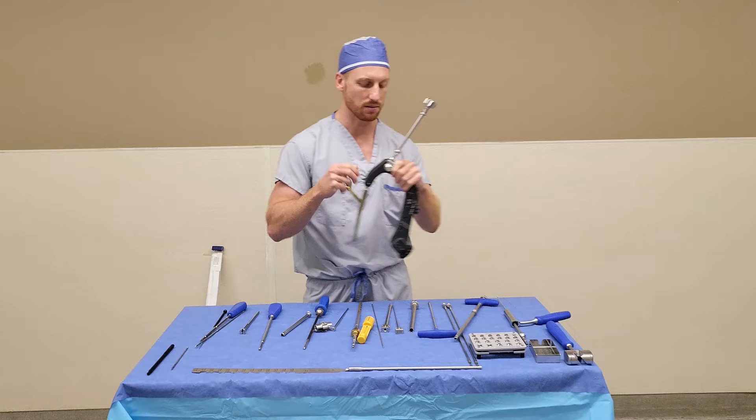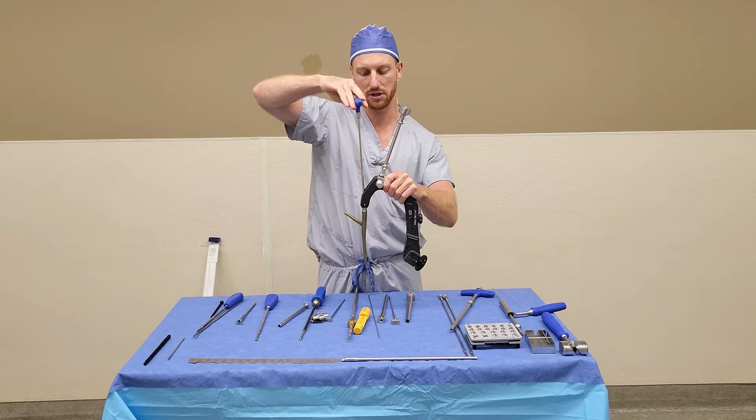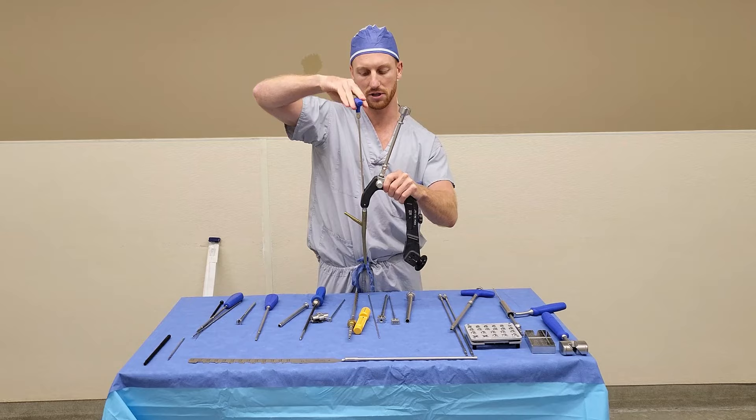After that, the last step is to disassemble the connecting screws. You go back to your blue T-handle connecting or coupling screwdriver and simply detach the nail from the jig. And that, folks, is the TFNA.